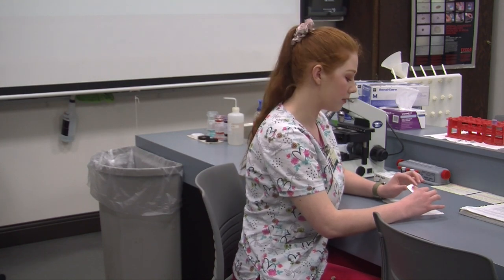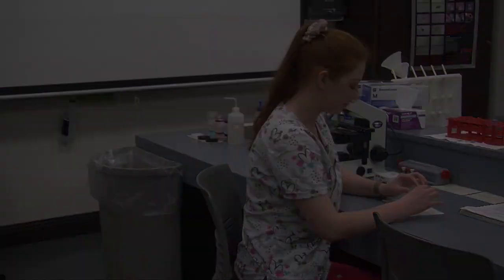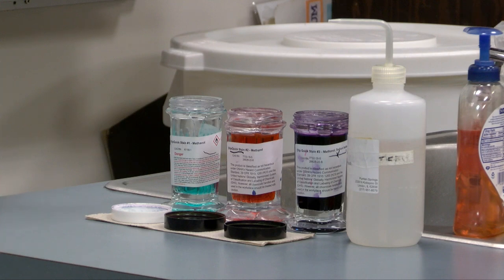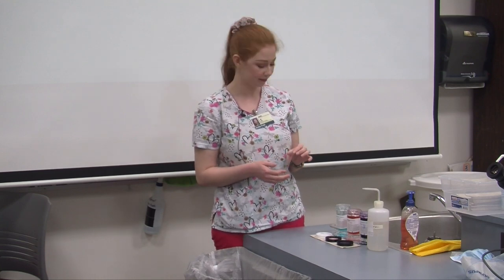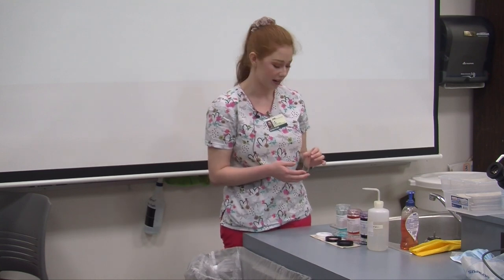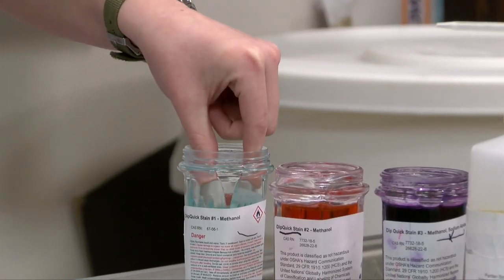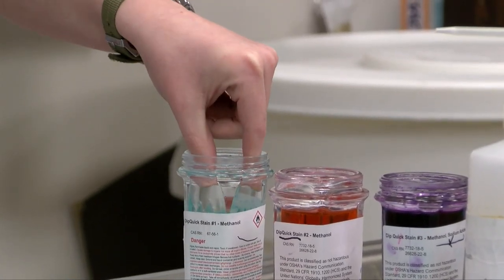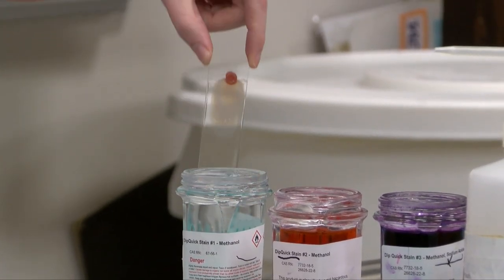Now what we're going to want to do before we examine our smear under the microscope is stain it. I'm going to head over to the staining station. First I'm going to dip my slide in the absolute methanol, which is our fixative solution. I'm going to do this five times: one, two, three, four, and five.